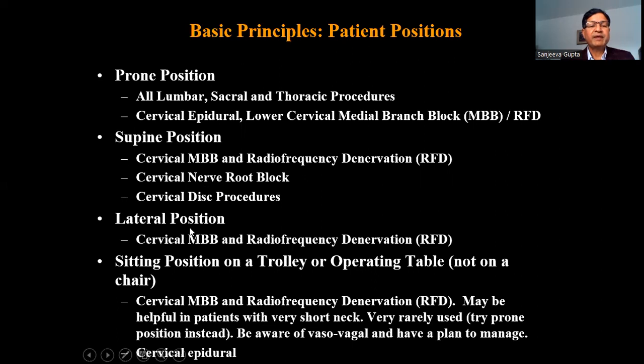In lateral position, cervical medial branch block and radiofrequency denervation. In my practice, lateral position is the default for me when I'm doing cervical medial branch blocks and RFs. But when I do a C7 medial branch RF, I prefer prone position, for reasons I'm going to describe later.